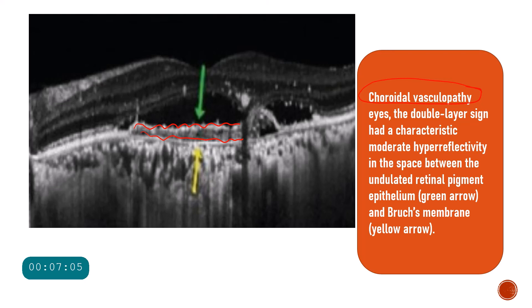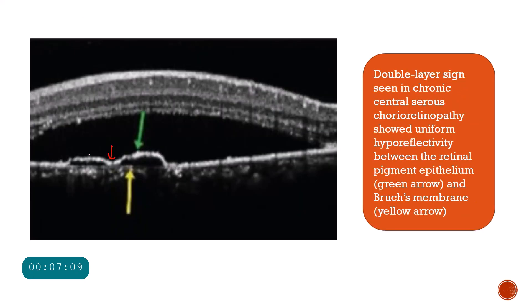Here you can also see the notch sign with two PEDs, and again you can see the RPE and Bruch's membrane forming the double layer sign. However, in this image there is a large amount of subretinal fluid causing the neurosensory retina to detach from the RPE — this is actually a chronic central serous chorioretinopathy case, which is also a part of the pachychoroid spectrum.